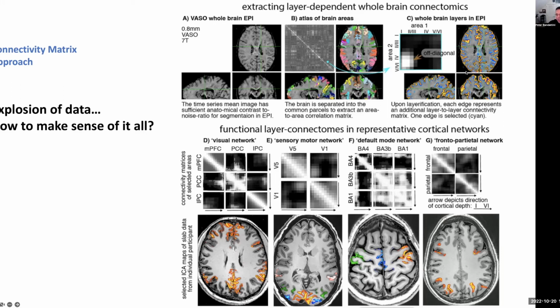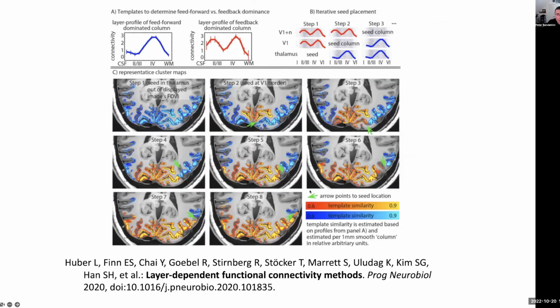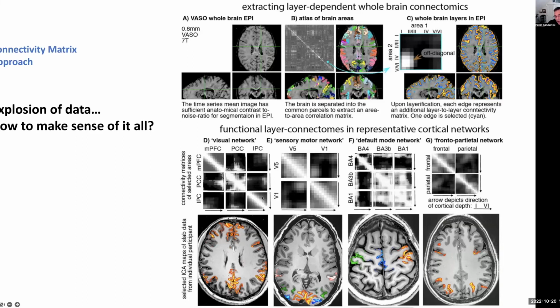It's an incredibly multidimensional problem that we haven't quite mastered yet. It takes a lot of computational power, but there are different ways of taking stabs at the data. Like I said, this way is one. It's more of a hypothesis-driven sort of approach. And so, yeah, we can make these connectivity matrices across layers within these networks, which works pretty well, but it still only gets a fraction of the data that we collect.